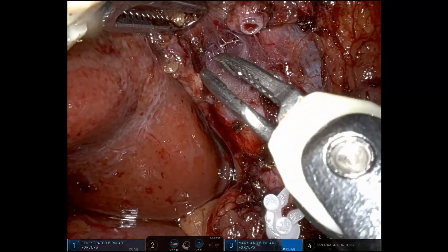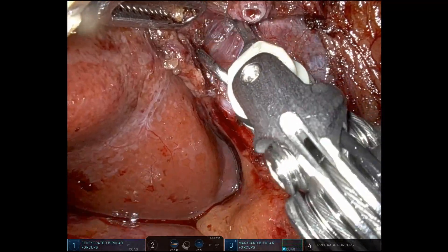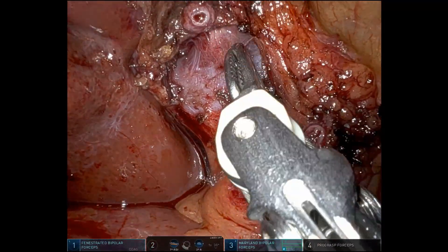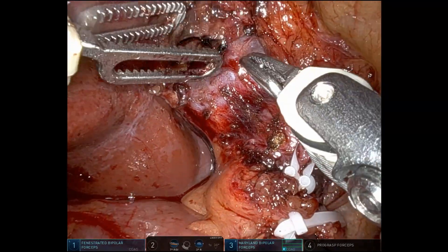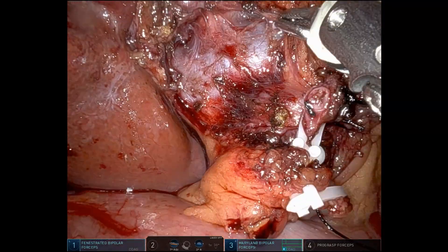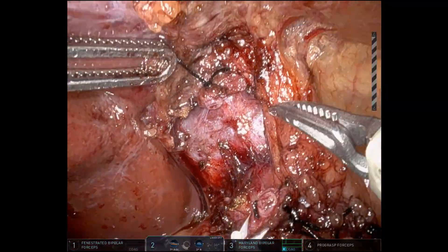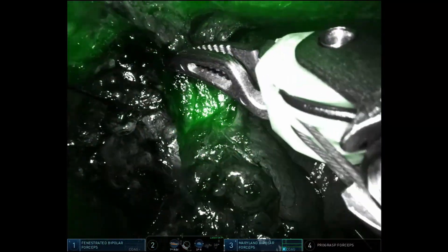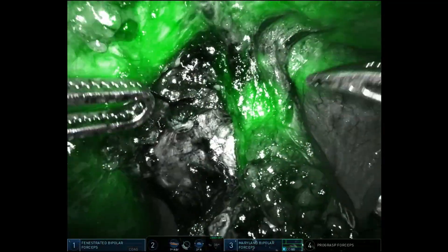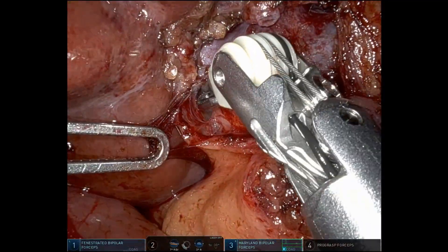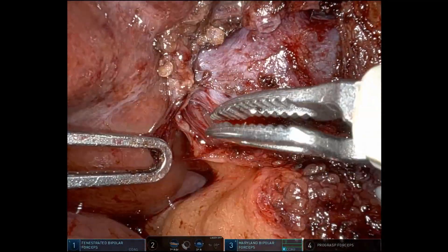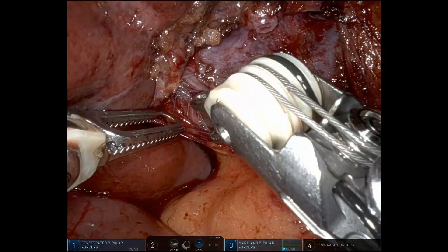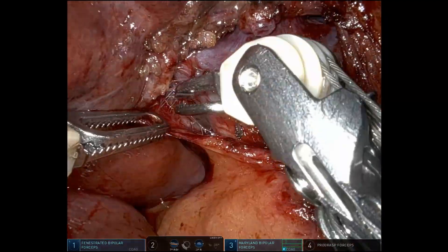Here we are isolating the right posterior portal pedicle. You can see just posterior to that artery is the anterior and now you're visualizing the left portal pedicle. So you can see all three of the branches there in that view. This patient had portal vein embolization of the right anterior and right posterior portal pedicles. There's ICG to see the hilar anatomy.